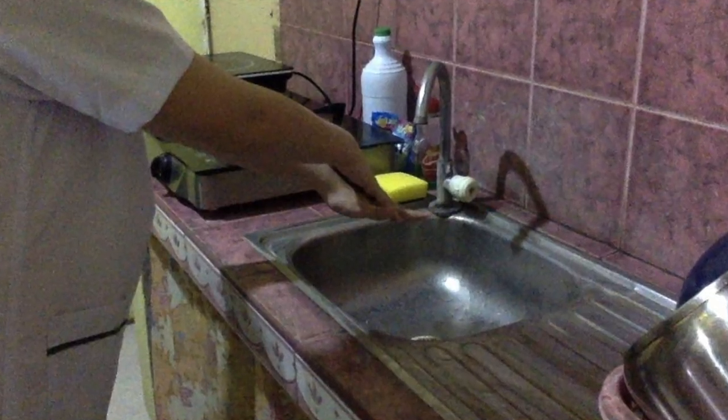First, perform hand hygiene. Hand hygiene is always done prior to any procedure or patient interaction. It prevents the transmission of microorganisms, which can lead to infection or complications that can be detrimental to the patient's health. The next step is to prepare all the materials or equipment needed.